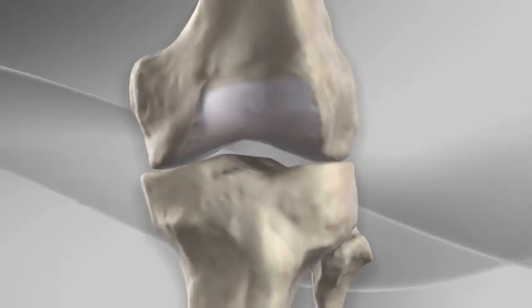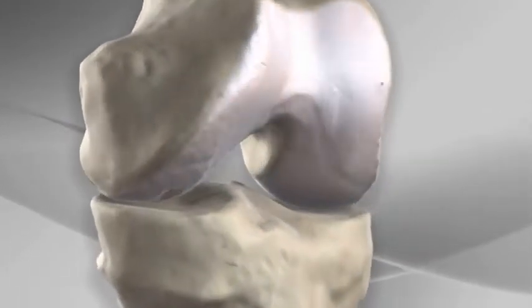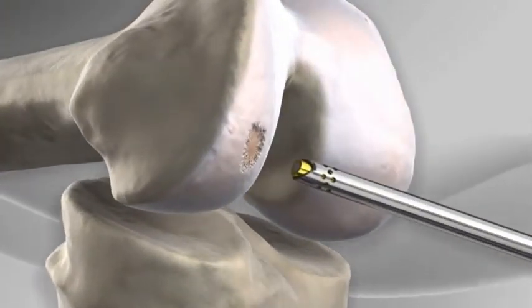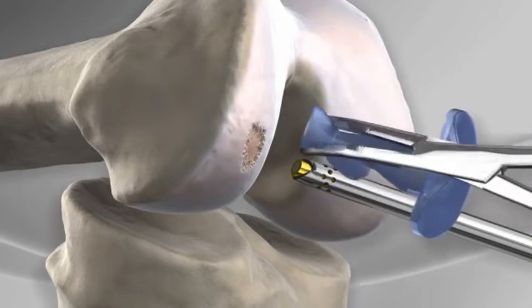The surgeon begins by creating two portals or small incisions in the front of the knee. The arthroscope is inserted through one portal and a passport cannula is inserted through the other.